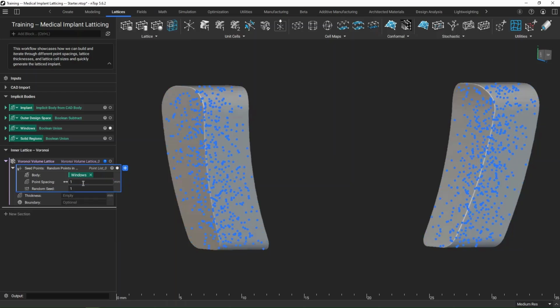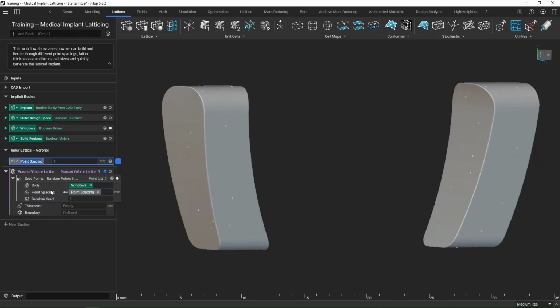But what I'm also going to do is make this input into a variable. So I'm going to right click, hit make variable. And then as you can see, now I have this variable that's just sitting on my notebook, and it's now living here as this little chip. Maybe you noticed that happened when I pulled the windows over to here. But the reason I'm doing that is because I know that this is going to be something that I'm going to want to play around with when I'm iterating and creating that custom block. So here I have it pulled out, ready to go.